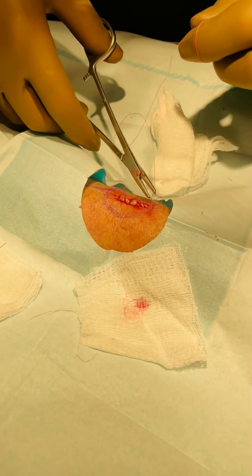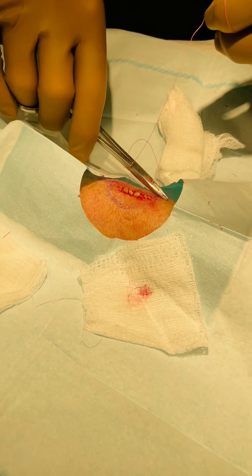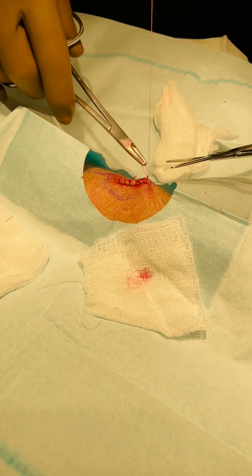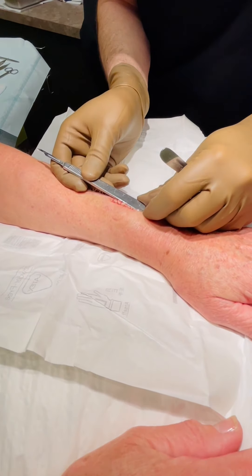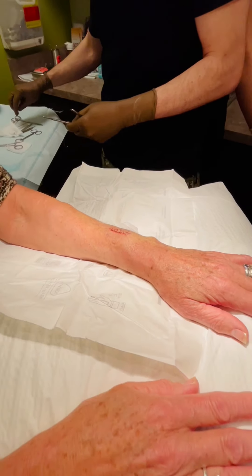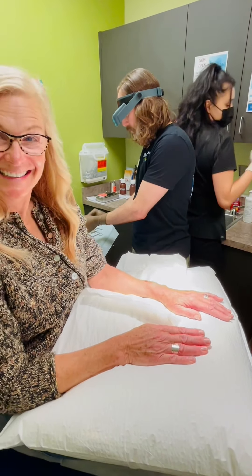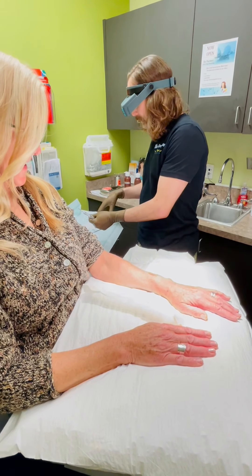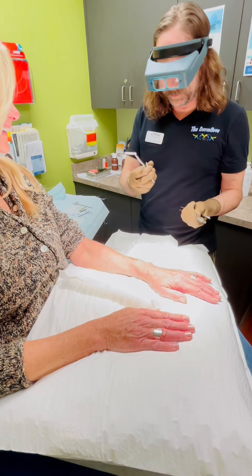Two running stitches. A couple of internal stitches. Can we get some peroxide? So that puckering will kind of go away - it's going to flatten down. And one of the things I like - we've got the blade here and remove it like that.